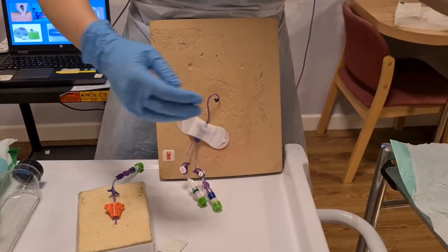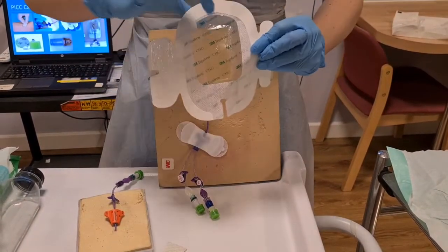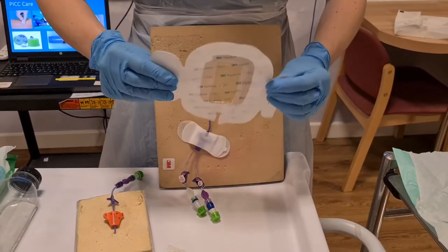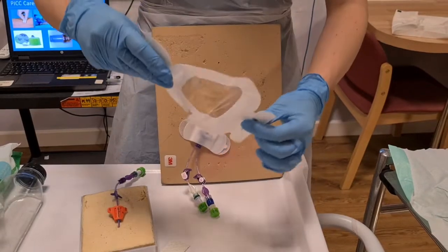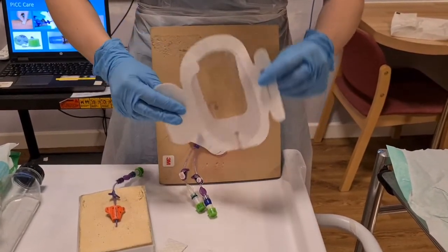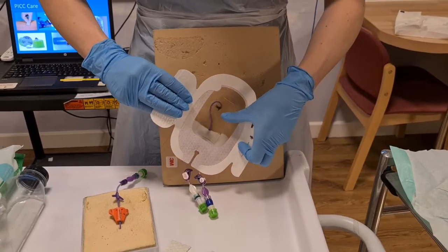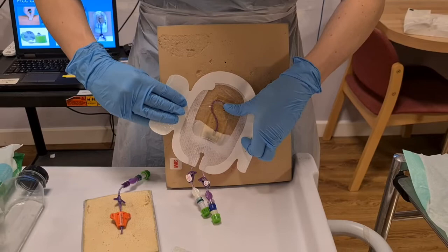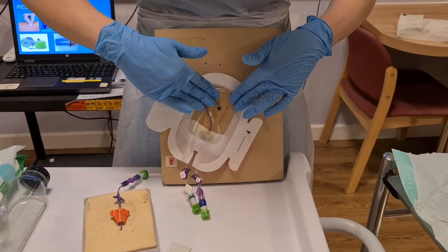Then I'm going to get my CHG dressing. You've got your chlorhexidine in the middle, so make sure that that goes directly over the insertion site, and never stretch this dressing. If you stretch it, the skin will ripple and potentially it could cause blistering. So what you want to do is just gently place it on, like so.